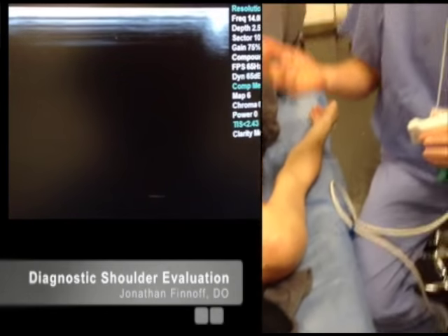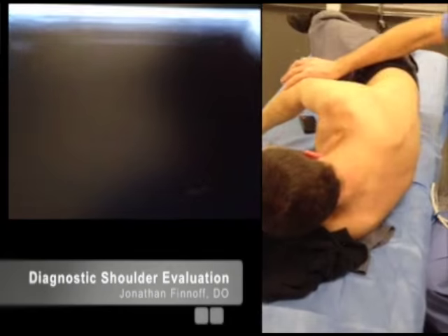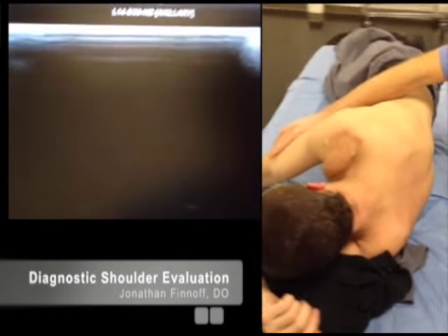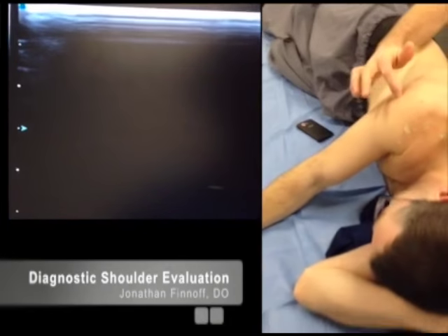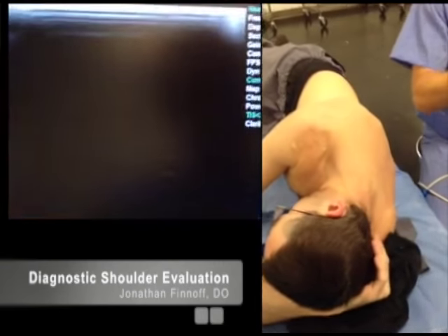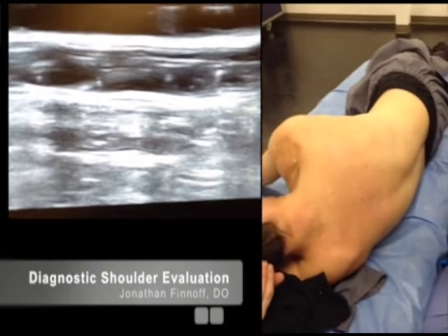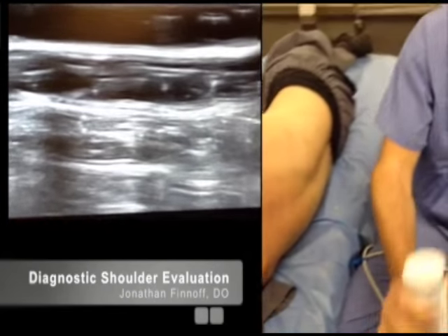Now roll up onto your left side facing away from me and let your arm drape across your front. In this position, we're going to look at the infraspinatus and teres minor — the posterior shoulder structures. I like to start off by looking at the infraspinatus in short axis, so I'll palpate the spine of the scapula.